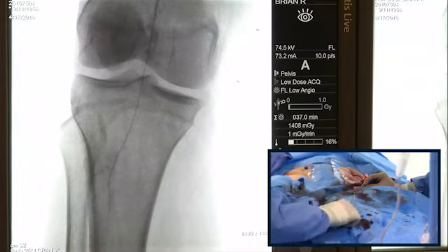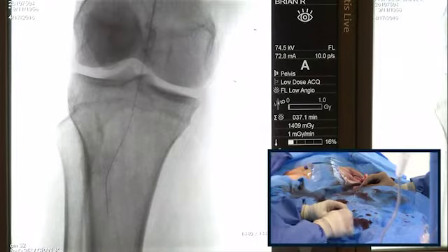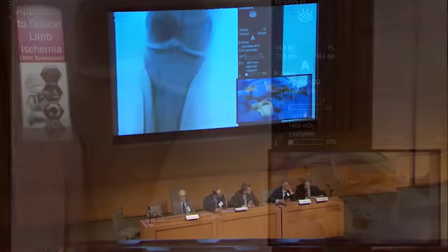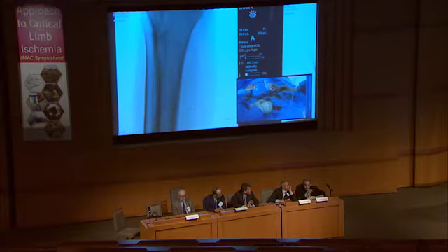Okay, it went. Great. So the other thing that can really be helpful here are the wires with micro braids. Those will really torque when coming around. We'll have a talk tomorrow on wire technology, but with the new micro braids, instead of just having either a nitinol or a stainless steel shaft, there's a micro braid around them, and you can torque them even with extreme tortuosity. Very nice.